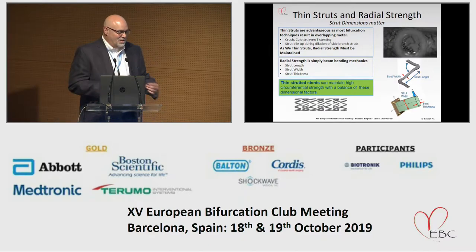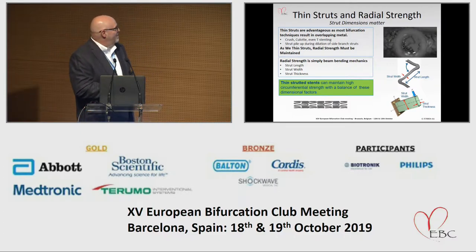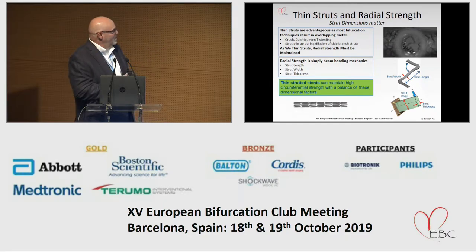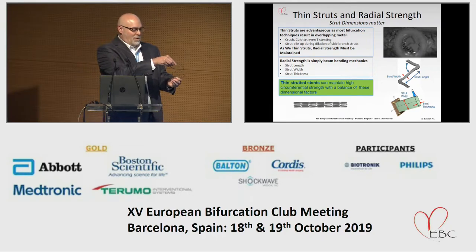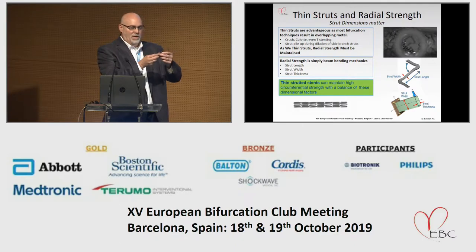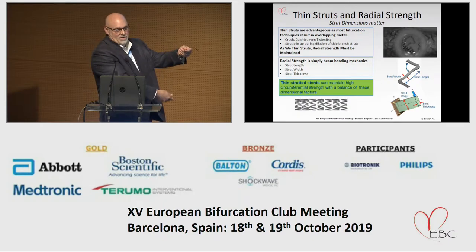And again, if you would direct your eyes towards me, look at the image in the lower left of a stent that is expanding and then being crushed slightly by a lesion, and I can duplicate that here with this simple piece of wire. So I expand the stent with the balloon. Essentially, I'm straightening out these zigzag shapes and the vessel's trying to crush it. If you just think about this motion, I am bending the stent in the plane of strut width, right? I am not bending this stent in the plane of strut thickness. This is purely strut width.